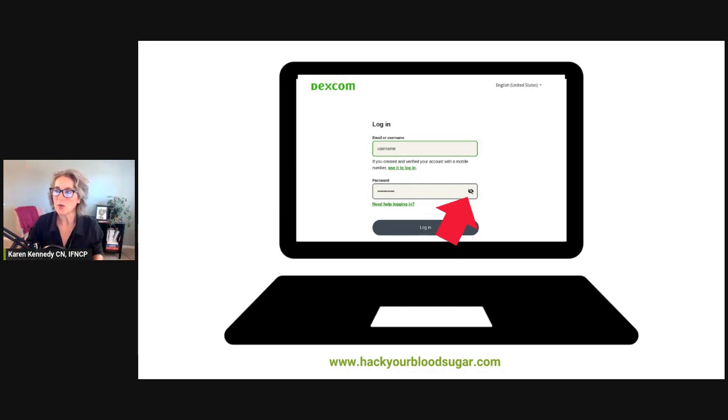And now you know. So I know that was a big hang up for a lot of us, but now you know how to do it and you can walk yourself through it and your clients.